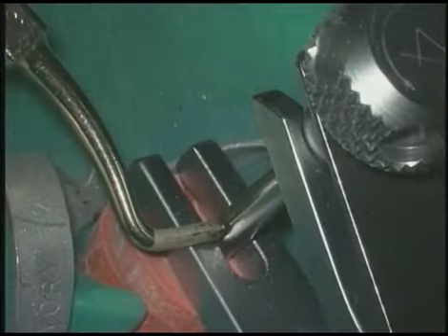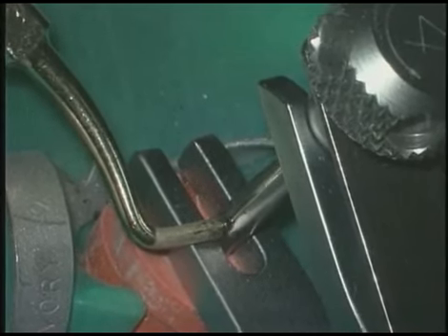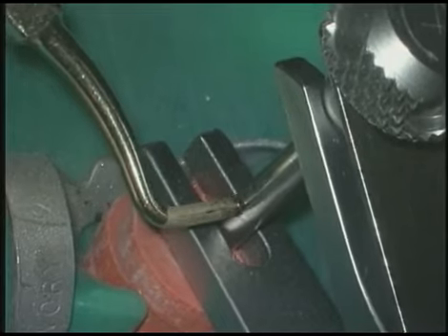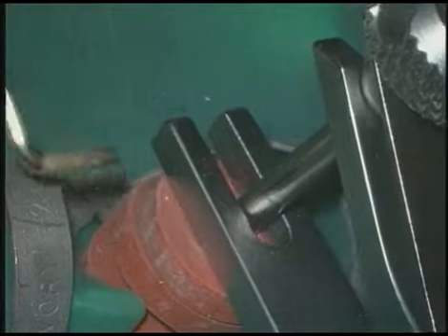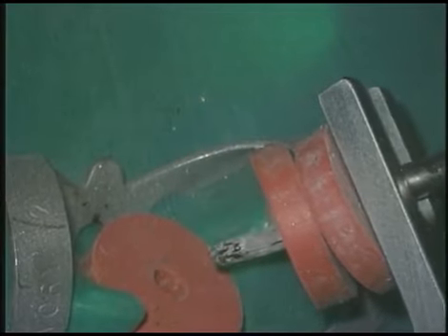If the handle ceases to turn easily, then we employ ultrasonics, as has been previously described. And ultrasonic energy will pass through the tube, down into the post, and begin to generate cement bond failure. Progress with ultrasonics until the mandrel and apparatus free up and elevate the post from the root canal system.